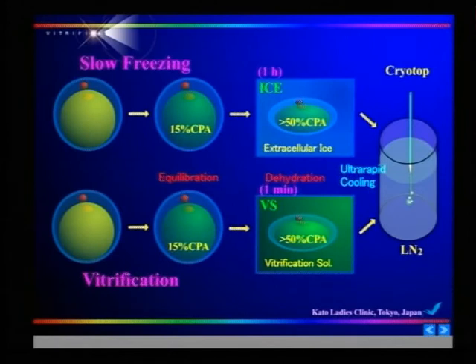So this method is simple. However, the vitrification solution contains a very high concentration of CPAs, so it gives physical toxicity because of the high concentration. How to reduce the toxicity of high concentrations of CPA has been the subject of research for these 20 years for vitrification.